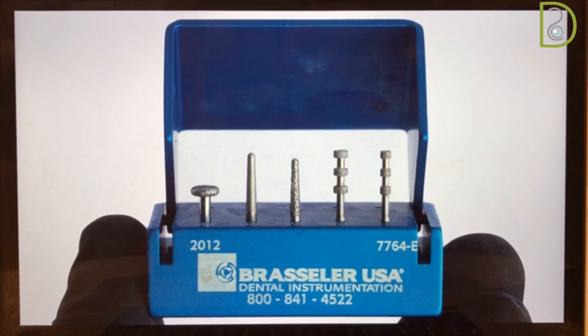So when it comes to that kit, usually those are the burrs we need for veneer preparation. Plus or minus, it depends. What do you like? What is your special preference? What makes you feel more comfortable? Just go ahead and choose it and start the preparation.